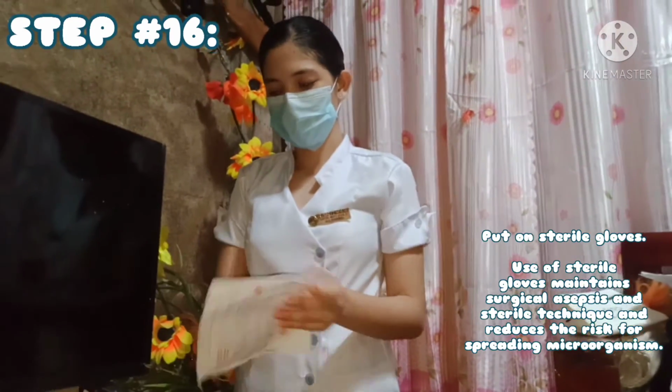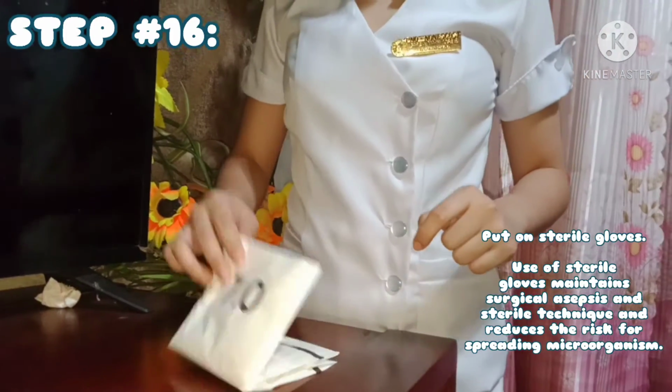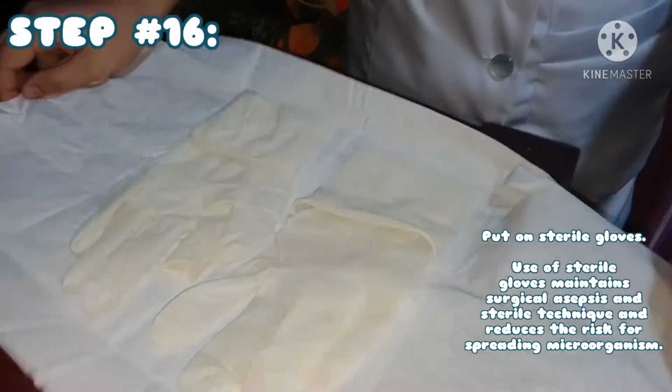Step number 16. Put on sterile gloves. Use of sterile gloves maintains surgical asepsis and sterile technique and reduces the risk for spreading microorganisms.